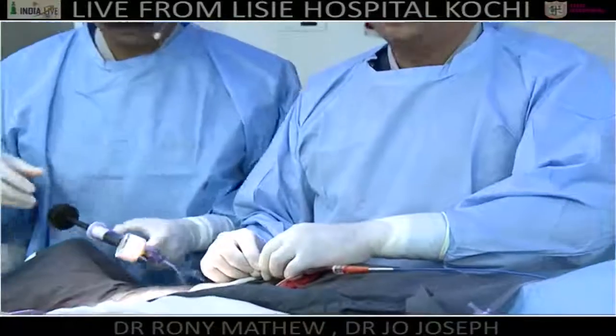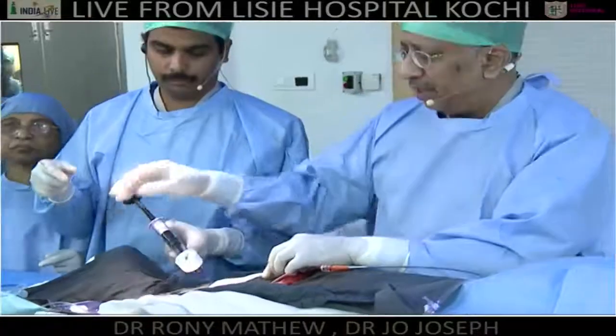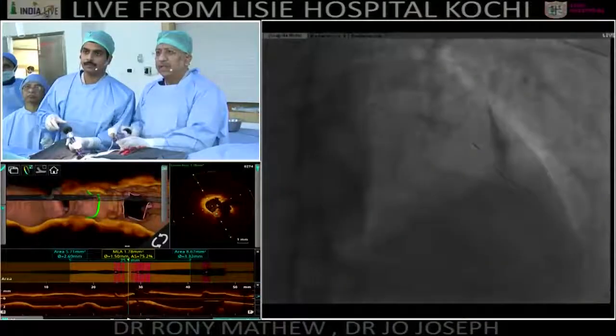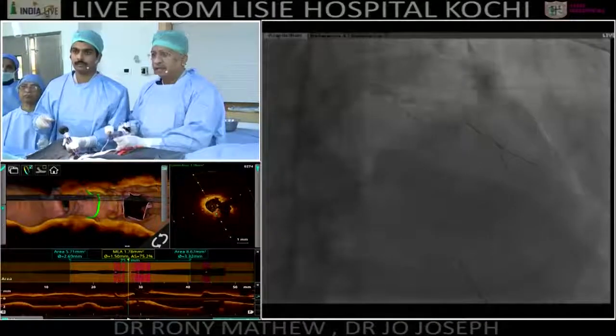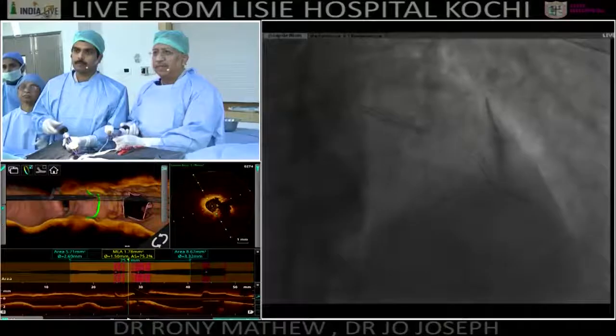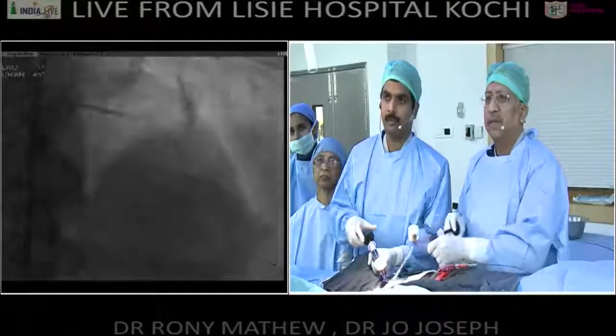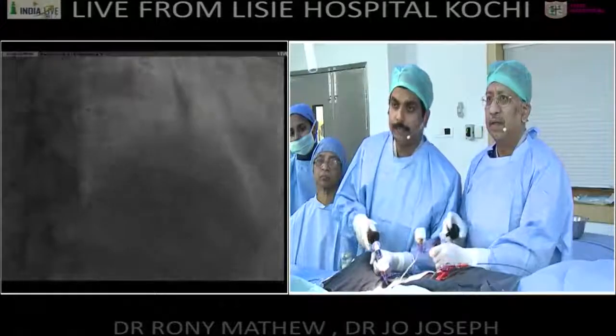Okay, so I'm just going to do a kiss over here. Diagonal. Let's go. Here, I'll just open the diagonal strut at 14 atmospheres. Get it down. I'm on the LAD.